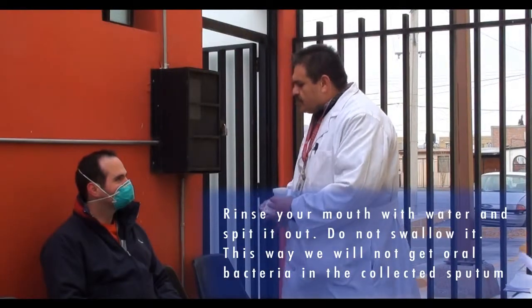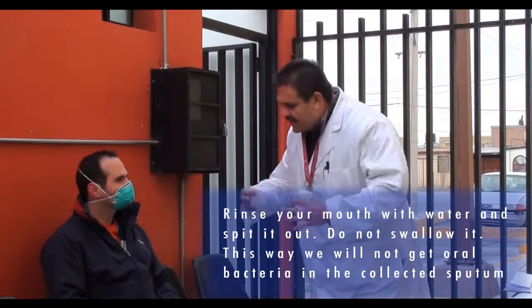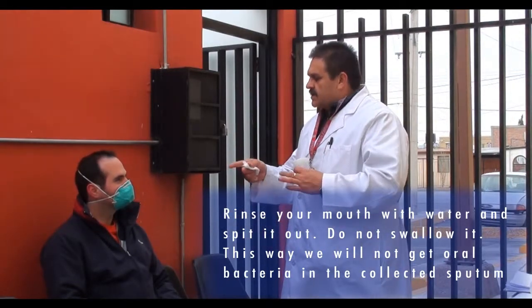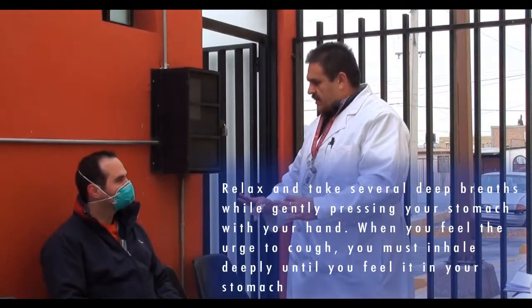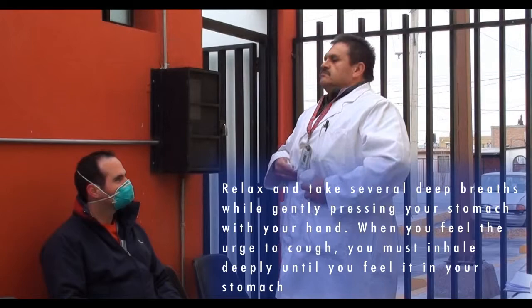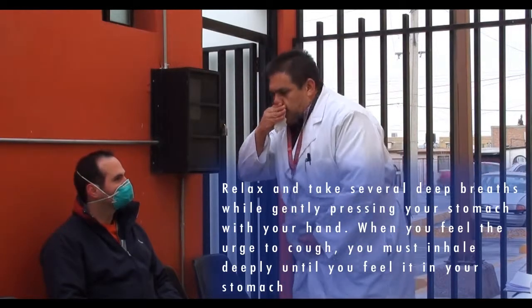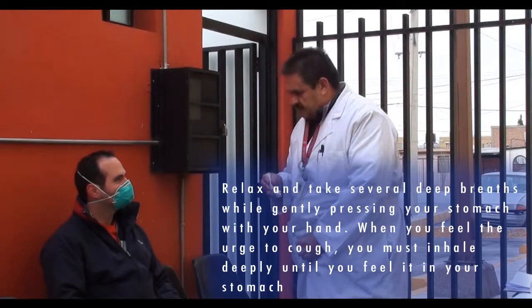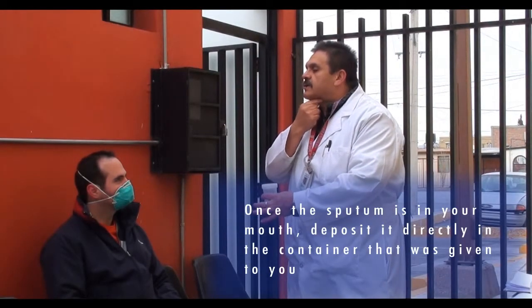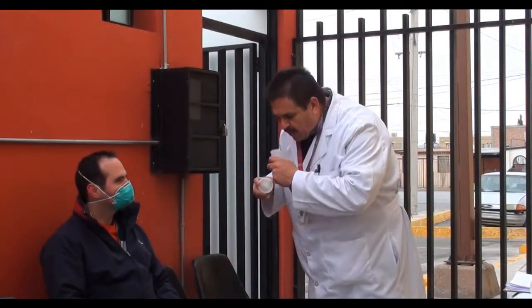Rinse your mouth with water and spit it out. Do not swallow it. This way, we will not get oral bacteria in the collected sputum. Relax and take several deep breaths while gently pressing your stomach with your hand. When you feel the urge to cough, you must inhale deeply until you feel it in your stomach. Once the sputum is in your mouth, deposit it directly in the container that was given to you.